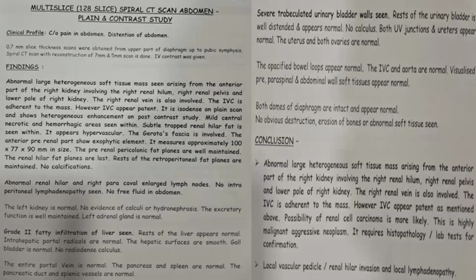Yes, sir. Okay, is the role clear for PET CT in the primary setting, sir? No role for PET CT scan in the primary setting because of the excretion of the FDG. No, that is okay. But what about this case?